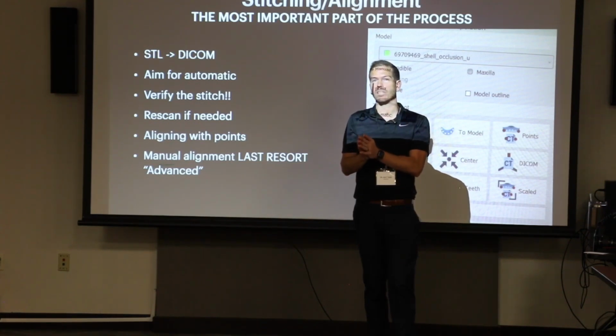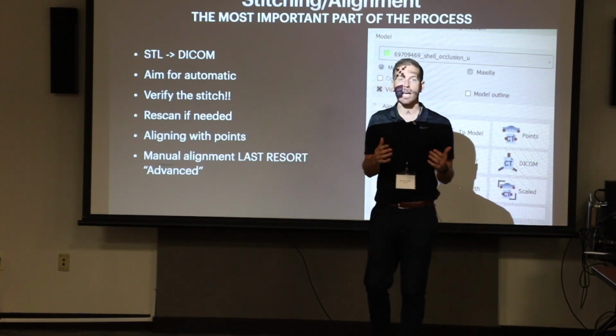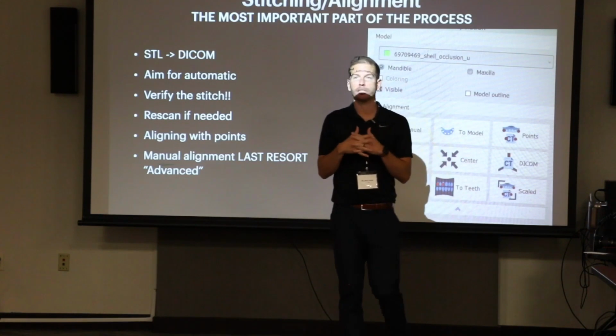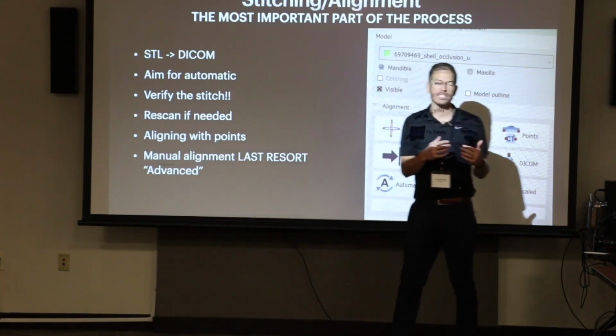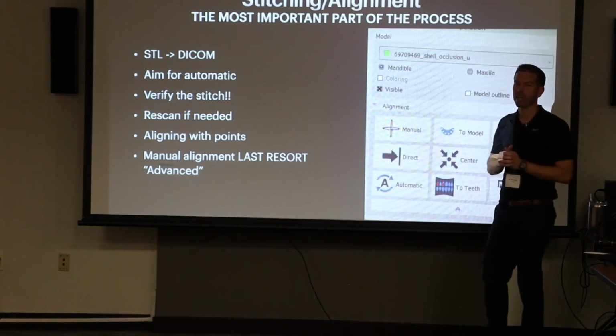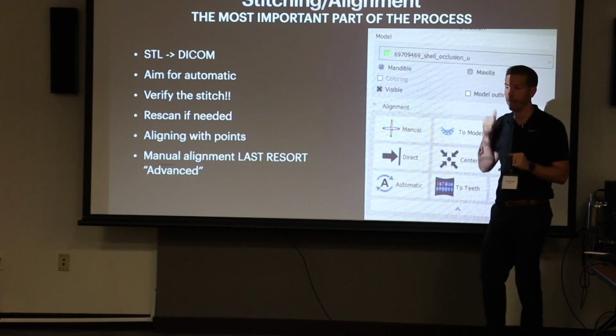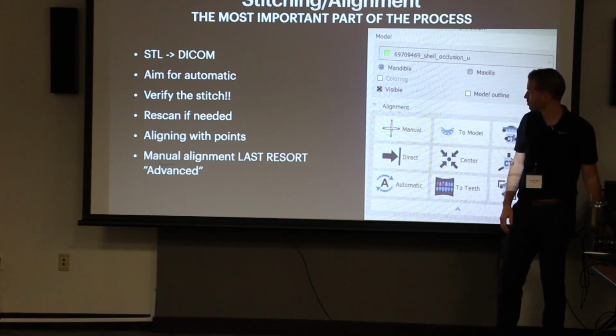and to ensure that the alignment was done correctly, because the software, 90% of the time, aligns it for us automatically just with the software's intelligence. But we still have to verify, because you can't just expect, oh, the software got it perfect. You have to be able to know how to look at it and realize that they were aligned right. I'm good to go. Let's move on to the next step. So we're going to be doing that today.